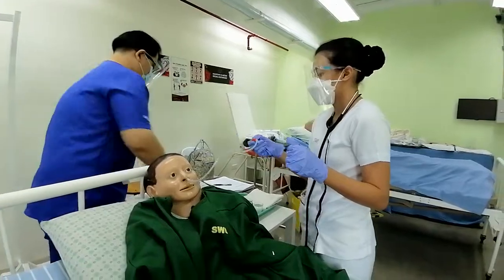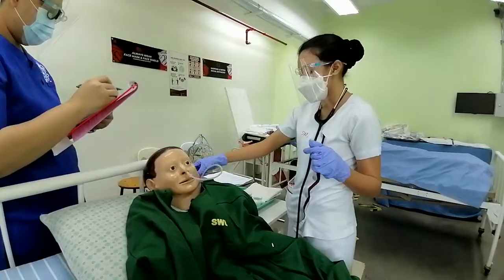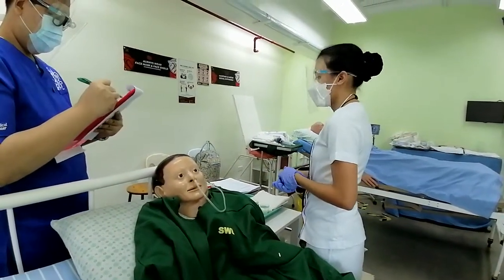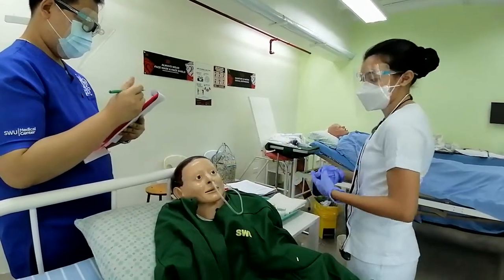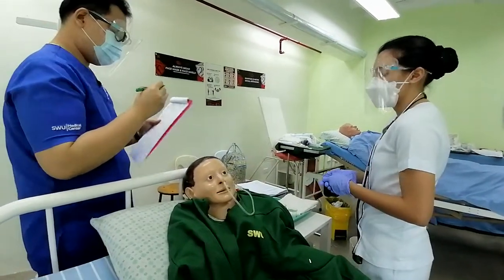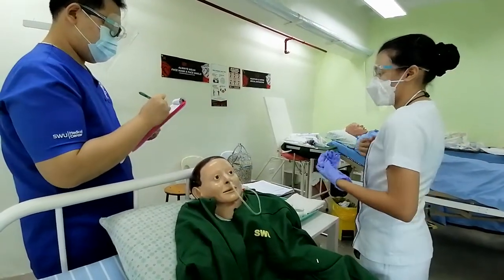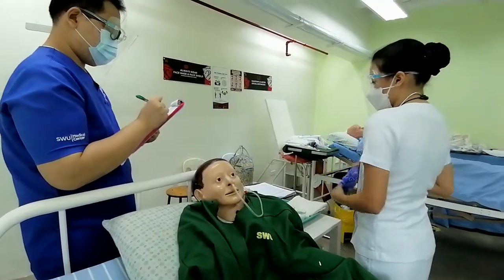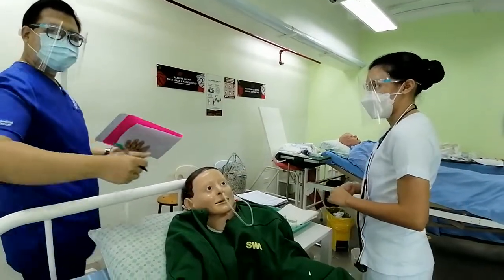So after that, sir, I will secure it with the patient's gown, remove my gloves, discard the materials, and perform hand hygiene. The purpose of which is to prevent microorganism contamination also. And then encourage the patient to stay in a high Fowler's position, probably within 30 minutes to 1 hour. This is also to avoid vomiting, what we have just said. And then do proper documentation as proof that the procedure was done.